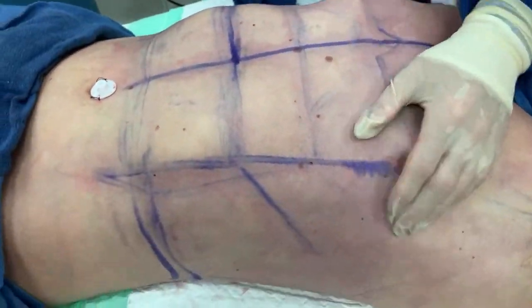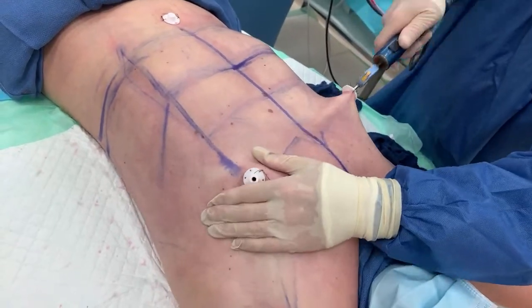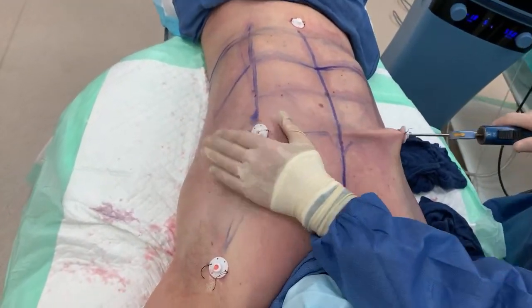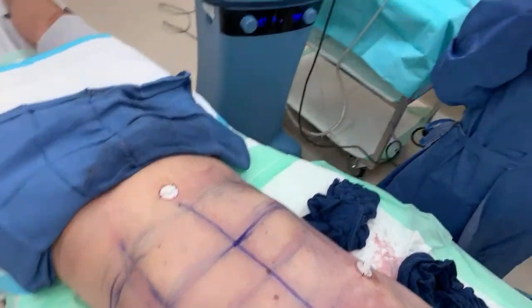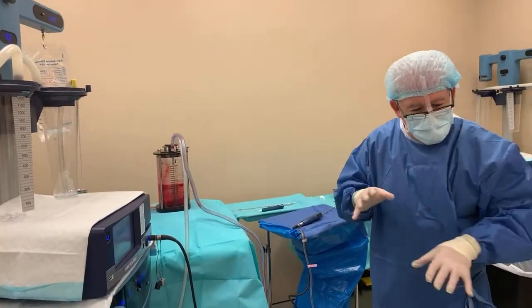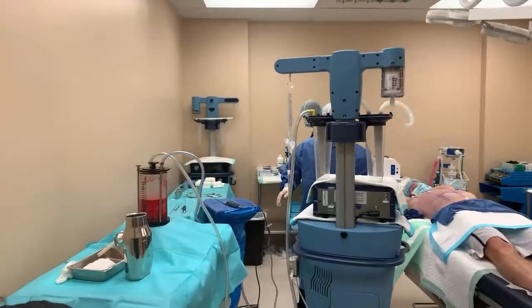What made you want to specialize in gyno? I don't know — I like it. When I first started, male plastic surgery wasn't a big thing. But now it's the fastest growing segment. Let's stop the suction for now. I'm going to take out the gland. Alright guys, we're going to head off — if you want to follow the rest of the surgery you can go to Instagram at Dr. Leibowitz.